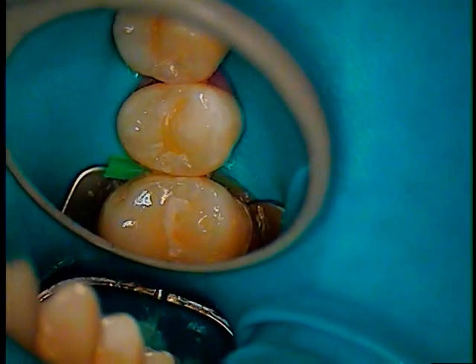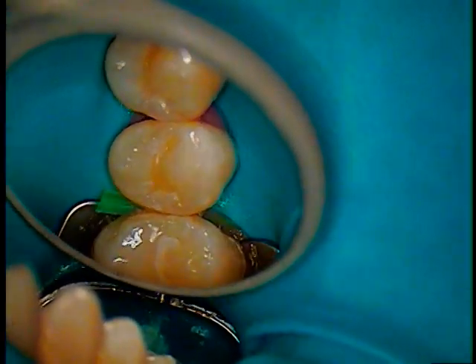A little bit about the cavity configuration factor. There is definitely a polymerization shrinkage factor that occurs with every composite, and so there are some discussions about the distal box and how to fill it, and whether to use vertical versus lateral curing, lateral condensation. I'm trying to give you my method here of paying attention to the various walls of the preparation as we move into our procedure.